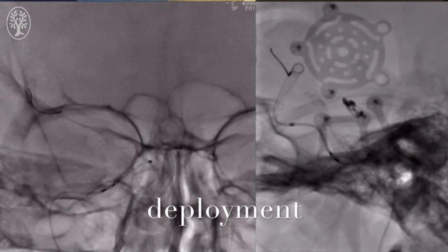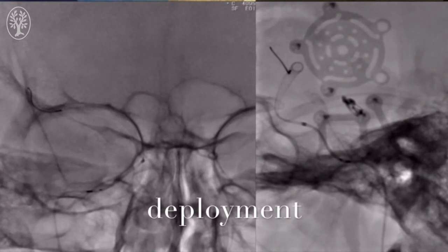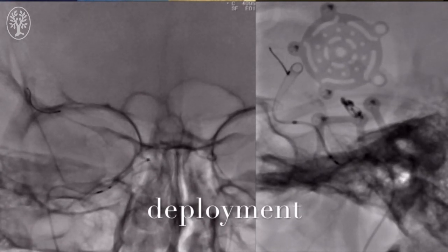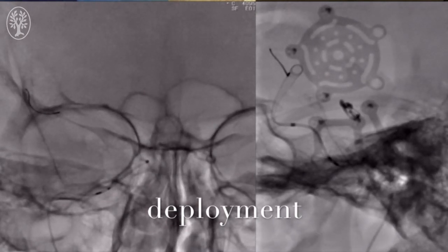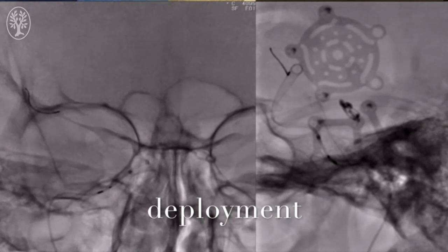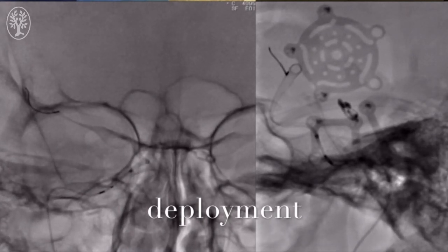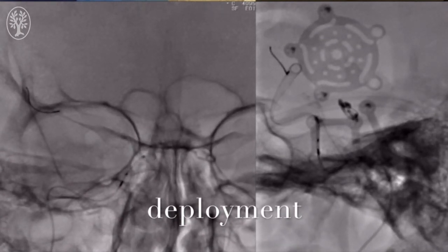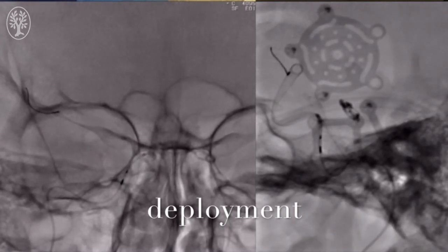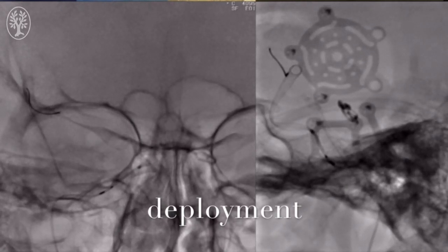Additional force is being applied to the microcatheter at this point to make sure full apposition is achieved, and you can see the catheter is being pushed forward. Additional maneuvers are being made with pulling and pushing the catheter to make it open up. You can see the device is somewhat elongated at this point, and there are additional forward forces applied, which makes the device open up farther in the horizontal segment, but the clinoidal segment remains somewhat flattened.